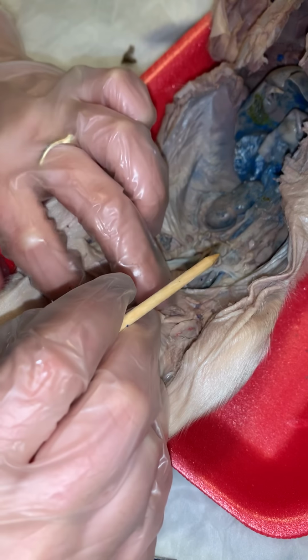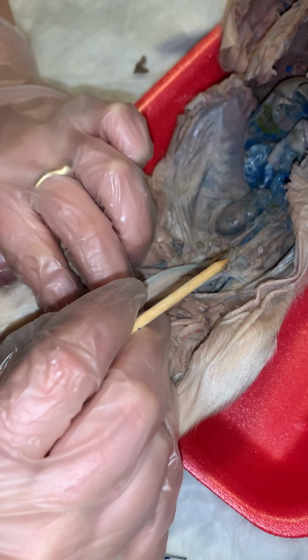And then the external iliac artery and the external iliac vein, those are located right here. Here's the vein, and the artery is right in here. You can see this little red area where my probe is. That runs up behind the vein.